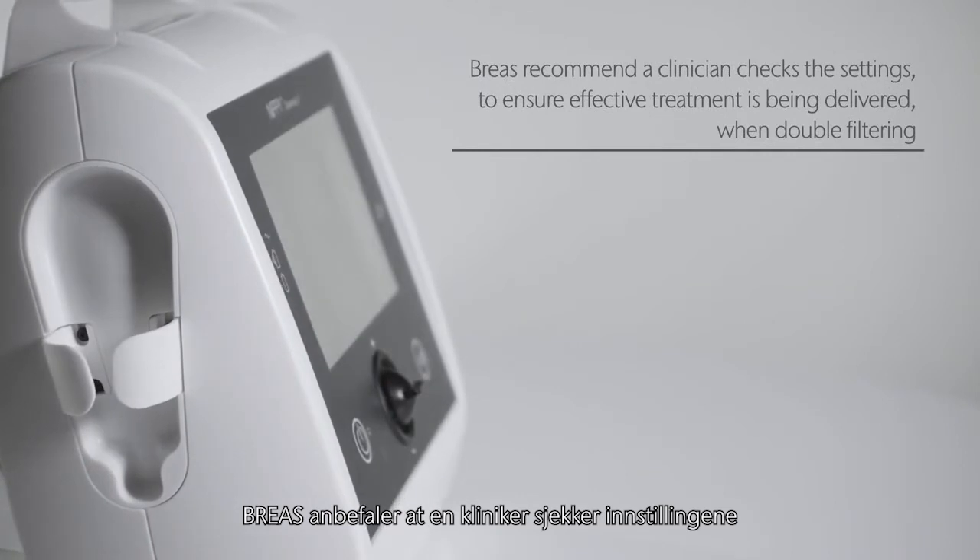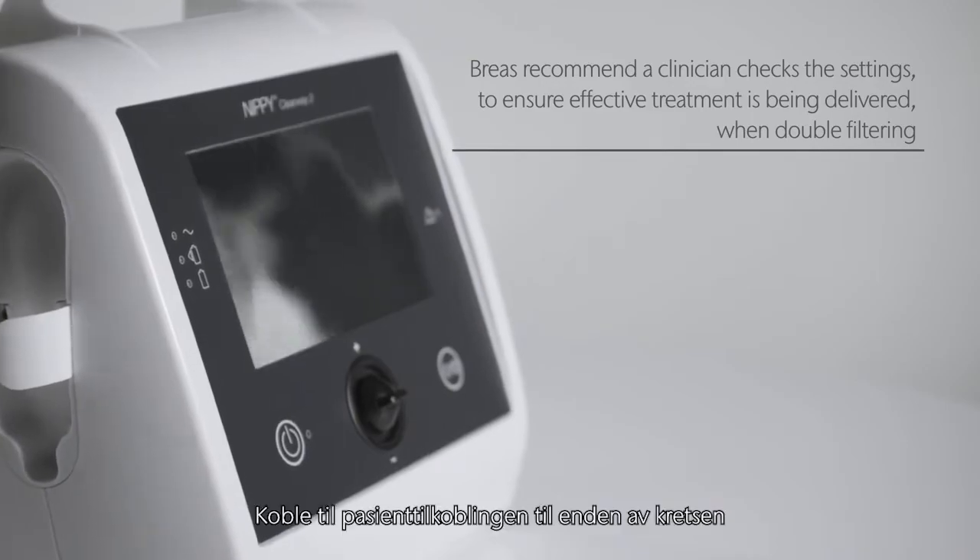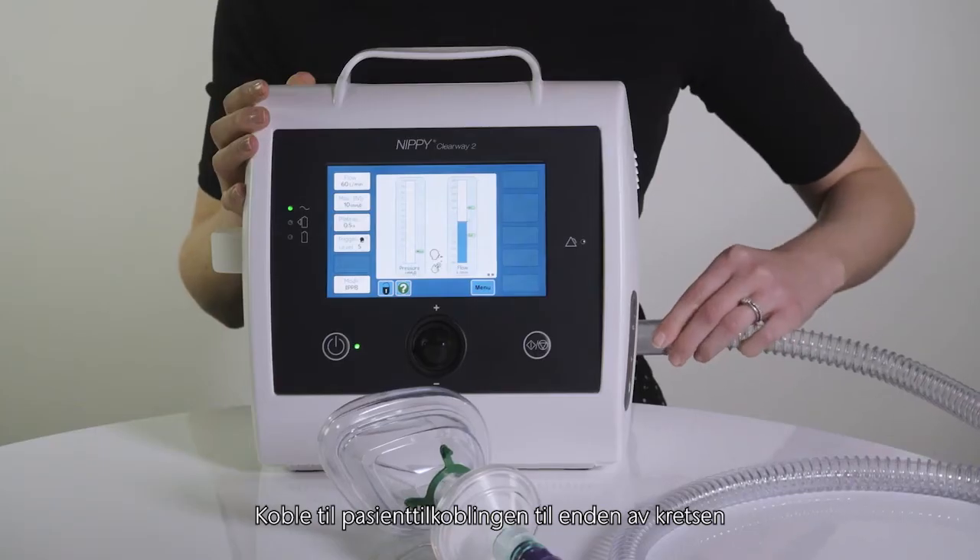Breas recommend a clinician checks the settings to ensure effective treatment is being delivered when double filtering. Connect the required interface to the end of the circuit.